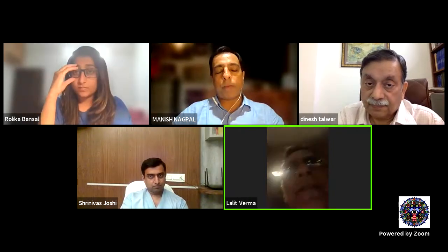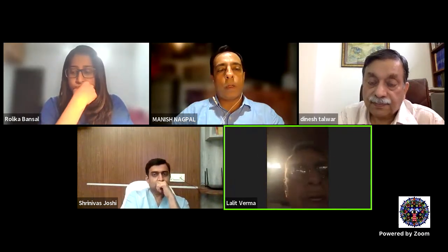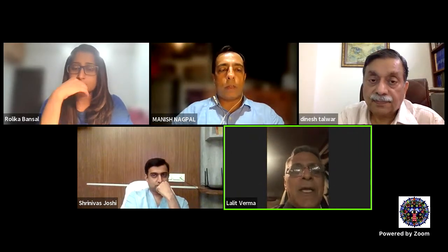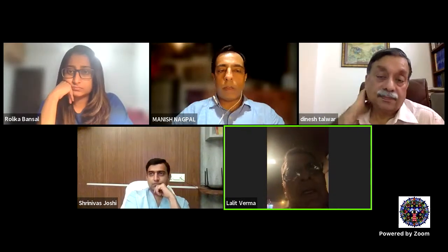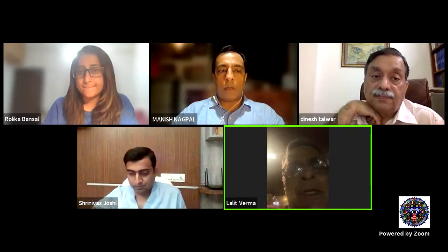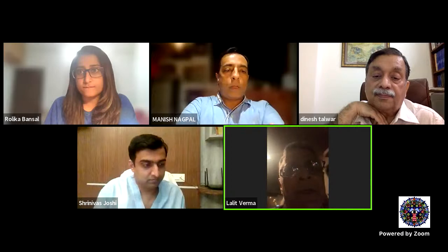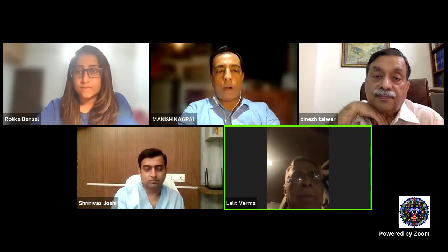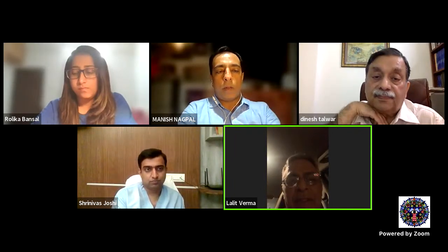Yeah. So there, you see, a lot of people today have a very low threshold for doing retinectomy. That's what I am scared of, and I normally do not teach like this. See, first, like you rightly said, it's always membrane surgery, and keep doing that until you see a foreshortened retina. But today a lot of younger people, specifically maybe Dinesh can add something to it, or Shrinivas, about this role of retinectomy. People resort to retinectomy very fast, Dinesh.